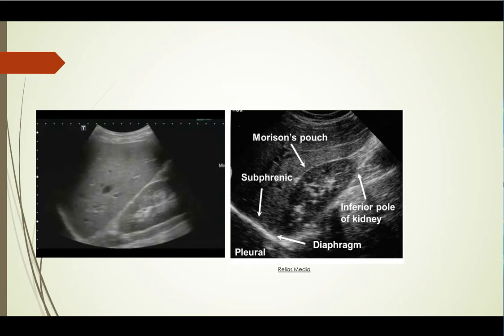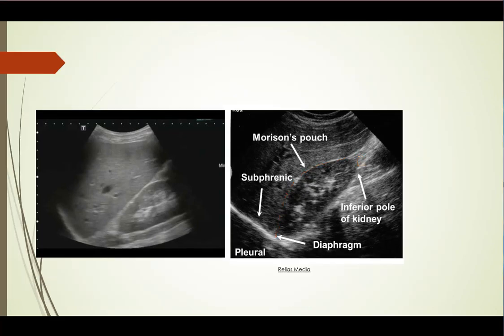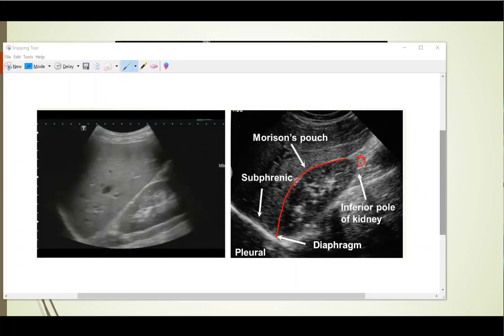Here's the anatomy marked. You can see Morrison's pouch runs right along here, and this is the inferior pole of the kidney. In terms of orientation: superior is heading toward the chest, inferior is heading down toward the feet, anterior is where you have your probe on the skin, and posterior is deeper into the body. This is the diaphragm right here heading up into the chest, and the spine is right down here — and we'll talk about what's called the spine sign.